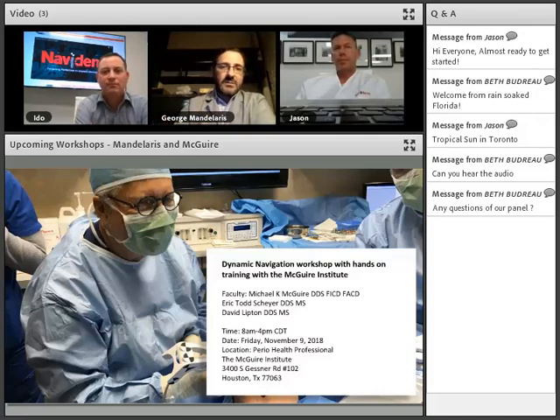One of the other things that we need to also be mindful of, because there will be critics, is that when you use the implant as a drill tip and you're registering the implant, there is the question: is there a potential now to develop a retrograde peri-implantitis? Yep. Okay.